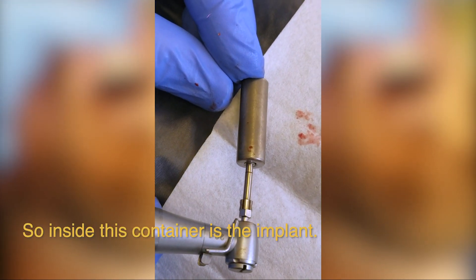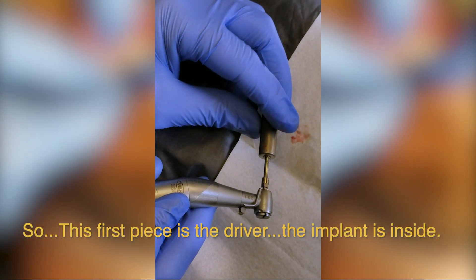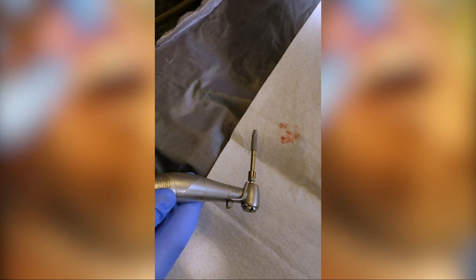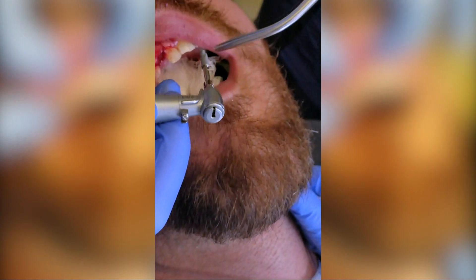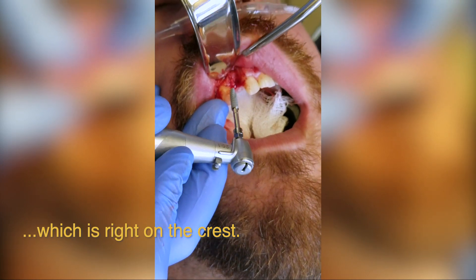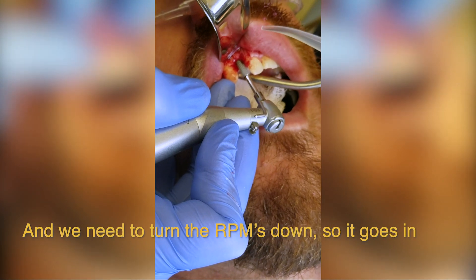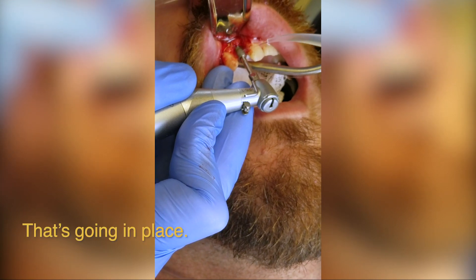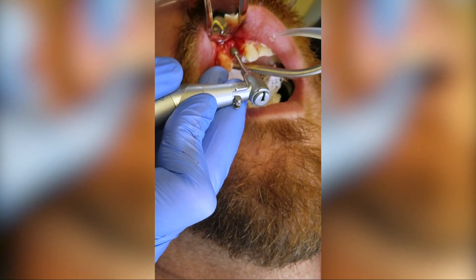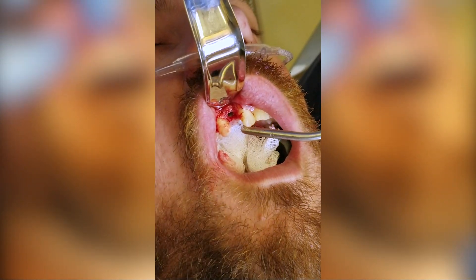Inside this container is the implant — and this is the unveiling. This first piece is the driver, and the implant is inside. This is a 3.5 millimeter diameter by 13 millimeter in length. We'll go back up to our surgical site. Nessa, go ahead and irrigate right on the crest — this is where we want this implant. We need to turn the RPMs down so it goes in nice and controlled. Implant's going in place.